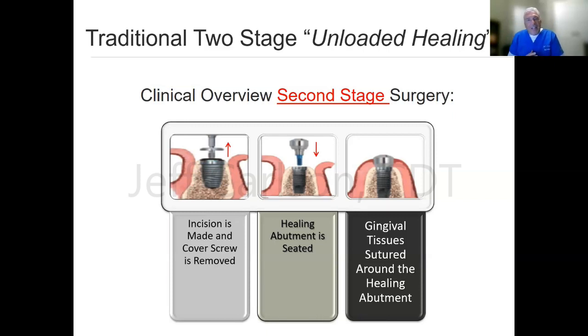You're going to find these contoured, oversized, if you will, healing abutments are really advantageous in your molars and even your premolars, but molars especially, because we don't want our crown to end up being like a tomato on a stick, so to speak. We want to have a nice emergence coming out, one for aesthetics, and secondly for function as far as hygiene as well. We don't want to create food traps in these cases. So the patient then would leave with an abutment placed.